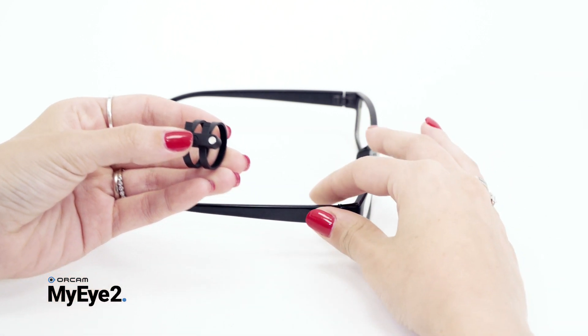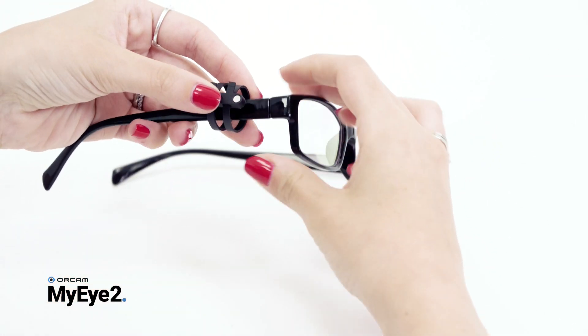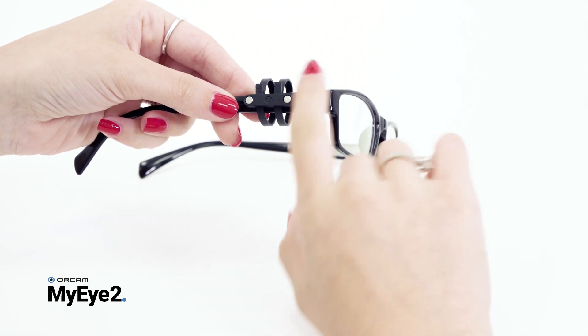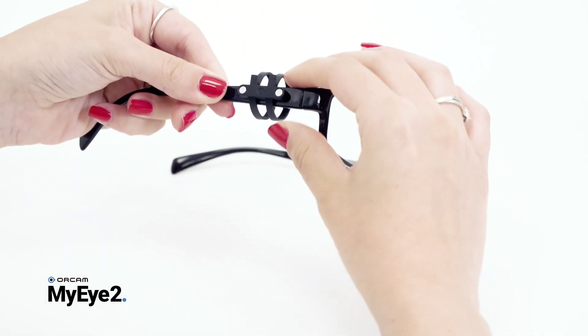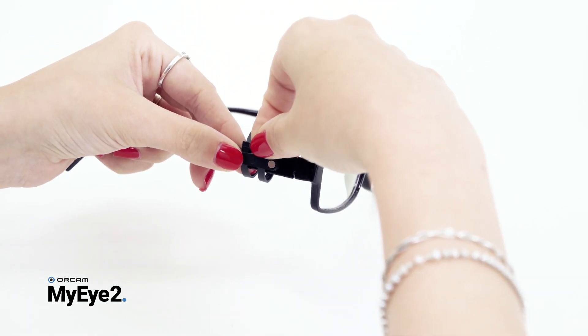Remove the white tab from the back of the mount. Slide the mount over the frame's arm with the magnets facing outwards and the strap facing upwards. Position the mount on the glasses arm at a distance from the hinge that is about the width of your pointing finger. Now press the mount onto the arm, making sure it is parallel to the arm. While holding the mount in position, pull the straps tightly upwards so that the mount is secured.